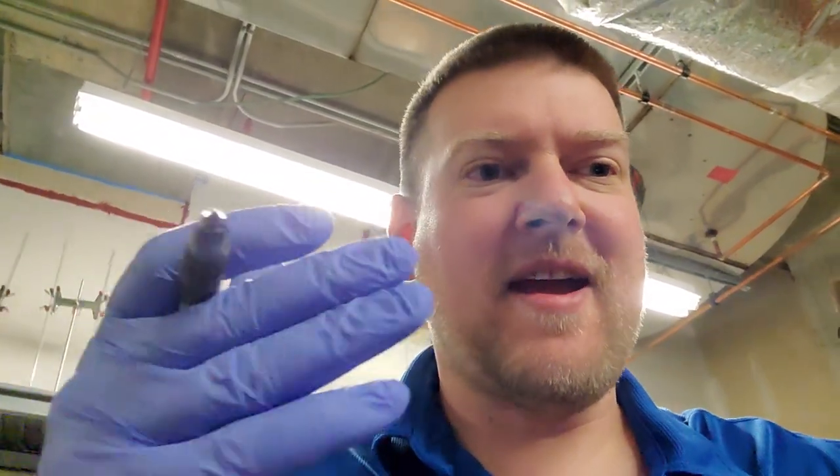Hey everyone, welcome back. I just discovered something that I didn't know — and maybe you guys do. I'm sitting here working on an investigation for a defibrillator and I took a look at the door and thought, huh, that's interesting. I never knew this existed, so let's take a look.